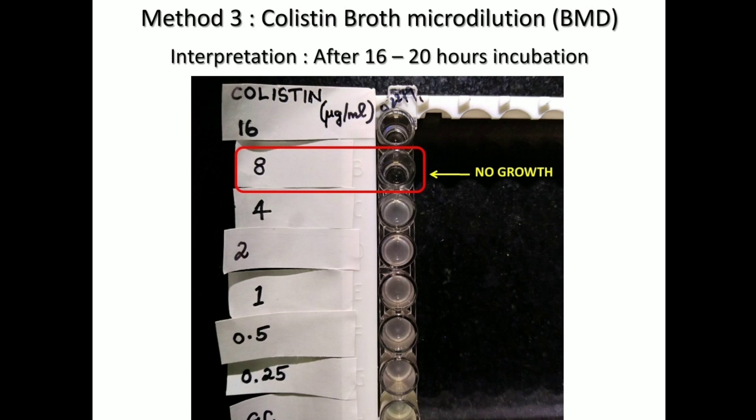After 16 to 20 hours of incubation, the well that has completely inhibited growth should be taken as the MIC value. Here we see that the 8 microgram per ml colistin well has completely inhibited the microorganism, so the MIC is 8 microgram per ml. According to the interpretive guideline, this isolate is resistant to colistin.